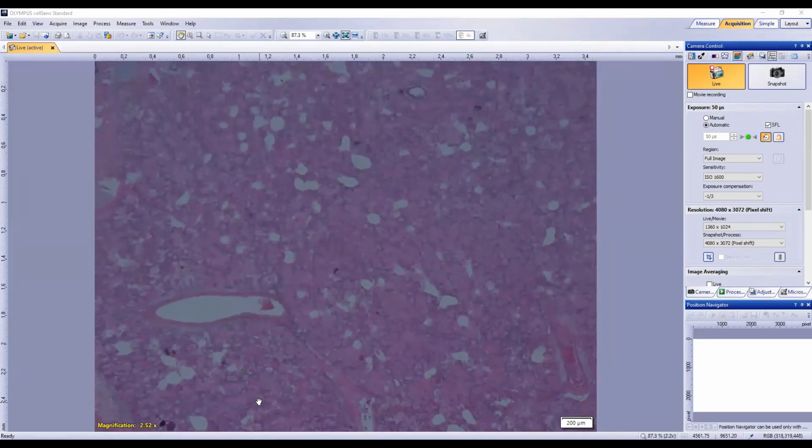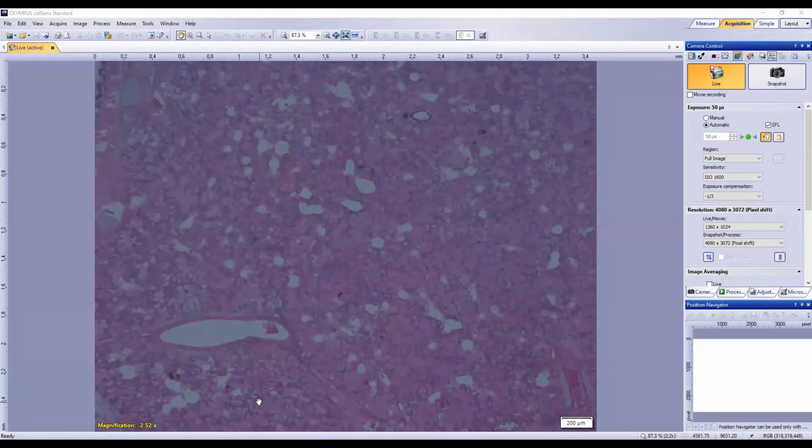Yeah, okay. So what can we see within the lumen? There seems to be like a granular material. I wonder if it's like a fungal organism in there. Yeah, okay. Because the tincture or the intensity of the staining changes a little bit from one location to another, doesn't it? Yeah, Anna, I love that description. That's brilliant. Eosinophilic homogeneous material within alveolar lumens. It's excellent. What can we see about the interstitia or the septa at this power?